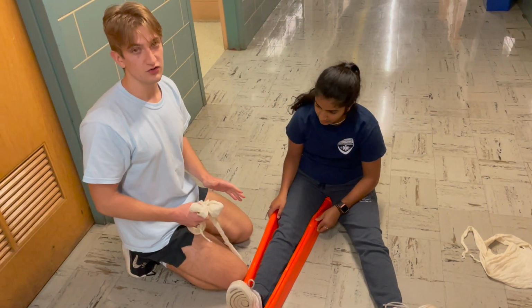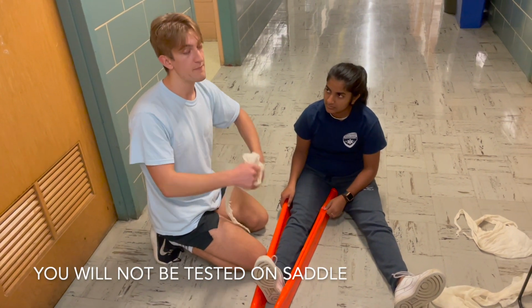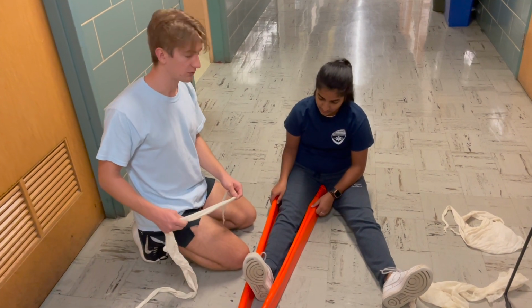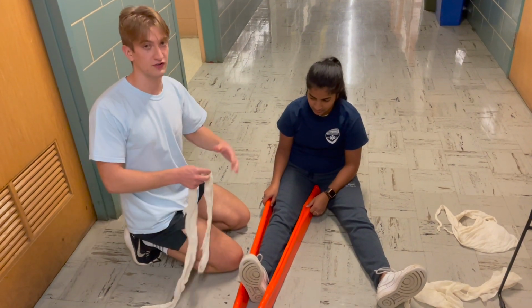There's 2 different ways to do a long bone splint. You can do the saddle splint, or you can just do the typical wrap around, which is all you're expected to know. I'm going to quickly demonstrate the saddle splint, which is a little bit more complicated, but can be more comfortable for a patient, so use your discretion.